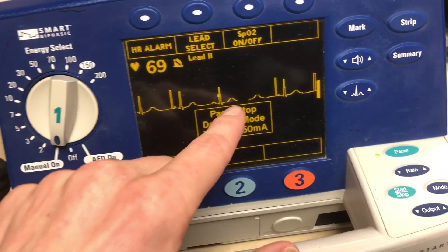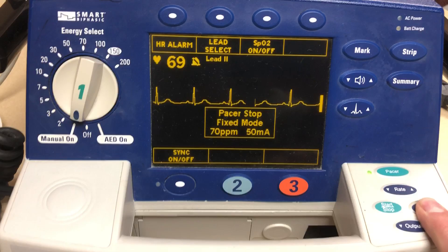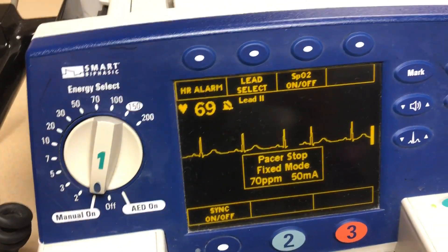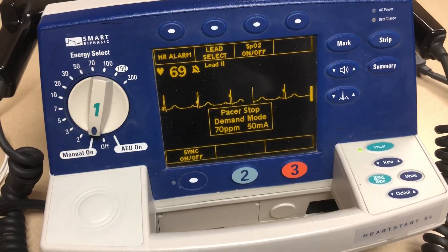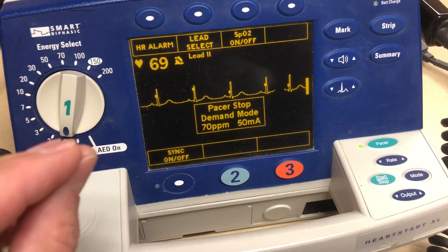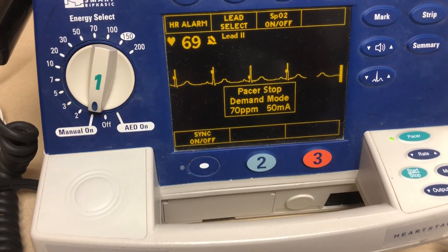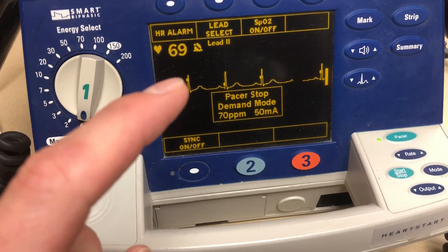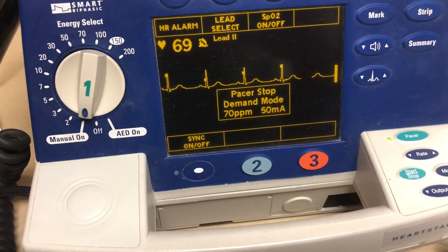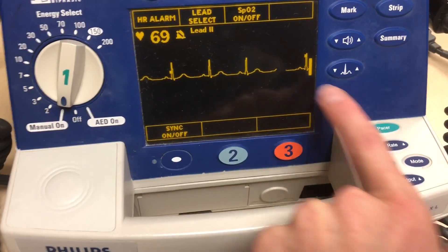There are two modes you can do with this pacer: demand mode and fixed mode. Fixed mode is just going to pace regardless of what's going on — it doesn't care what the patient's underlying rhythm is, it's just going to town. Demand mode is going to say, if this patient's flipping in and out of a bradycardic rhythm and then a rhythm above what we're pacing at — say we're at 70 and they flip back into a normal sinus rhythm at 80 — it's going to say, I see that they're actually there, I'm not going to pace. The best thing to do is keep them in demand mode, because if you accidentally start pacing on top of their QRSs, you could throw them into some sort of ventricular dysrhythmia. When you turn the pacer on it's going to sync automatically; when you turn the pacer off, the sync goes away.